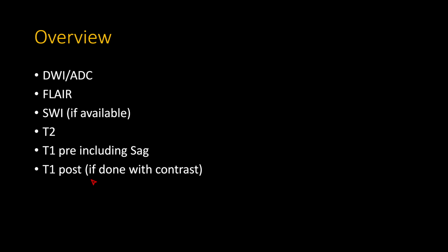Note that the purpose of the talk is on just routine brain MRI. We're not going to talk about those high resolution, skull base, high resolution sella, etc., which have their own very specific things to look at, and you need to know a lot more detailed anatomy to do those.